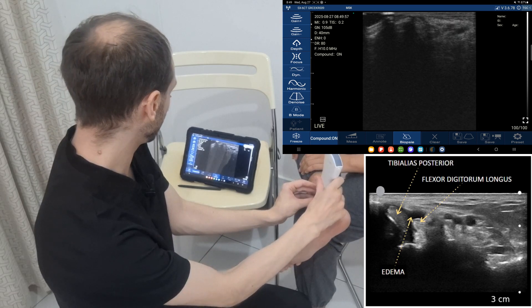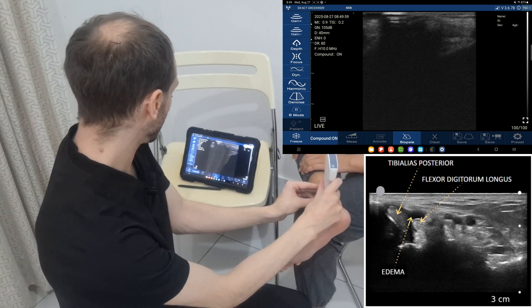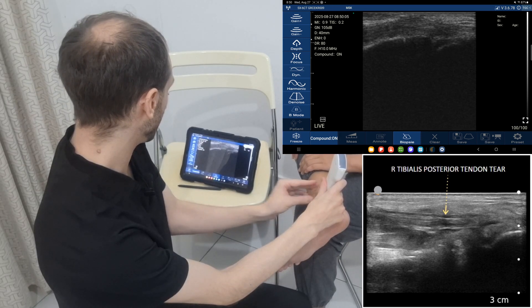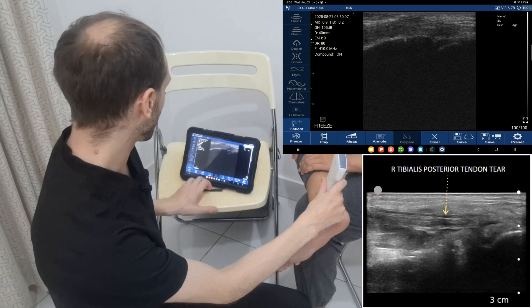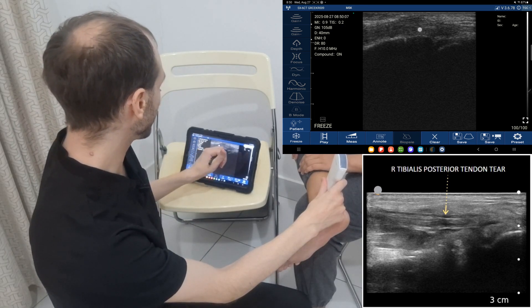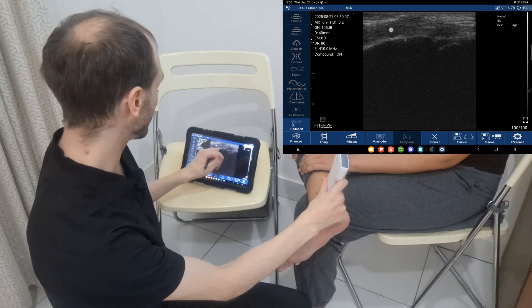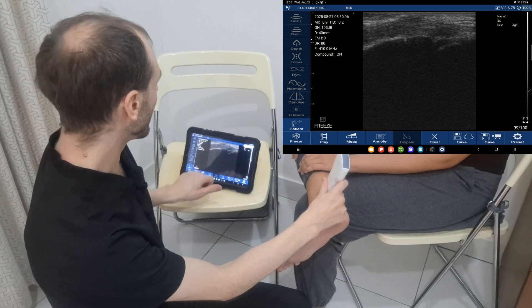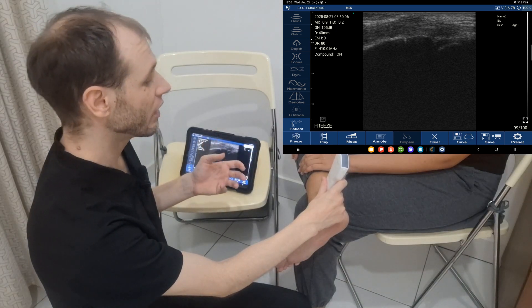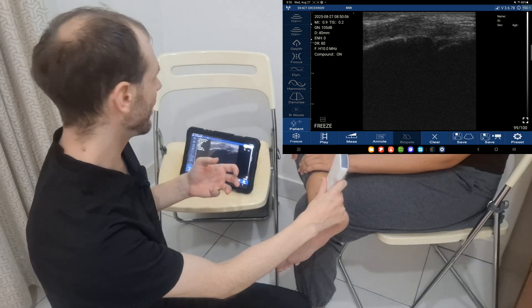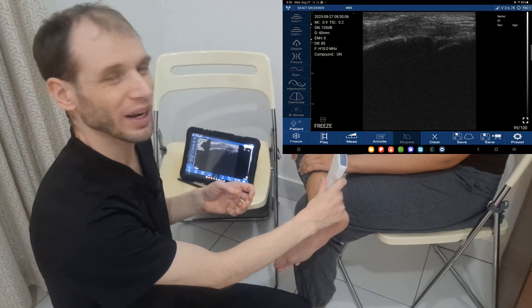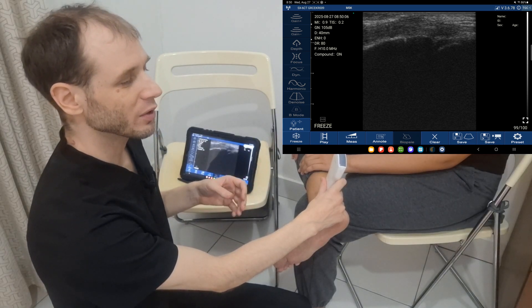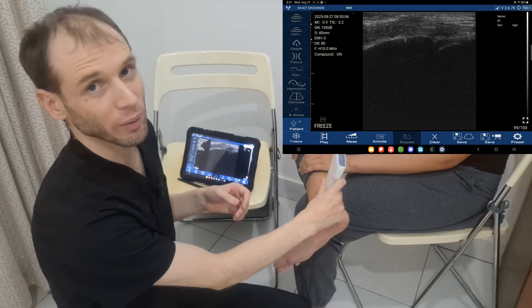Let's rotate this 90 degrees along the path of the tendon. There's the tendon in long axis. What we're looking for is basically a tear — a discontinuity of the fibers — and possibly a tendinosis if it's hypoechoic and thickened. That can be difficult to determine due to the nature of this tendon and how tricky it is to get a good picture without anisotropy. You can also compare with the other side, so you have an asymptomatic and a symptomatic for comparison.